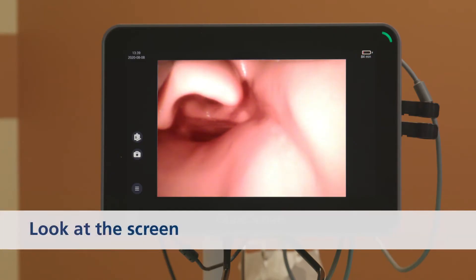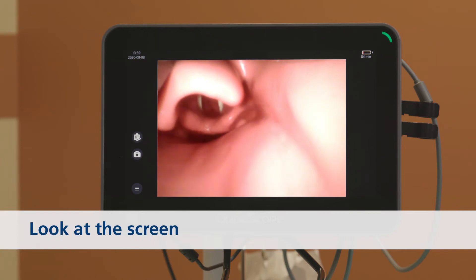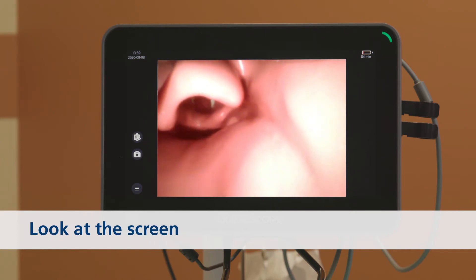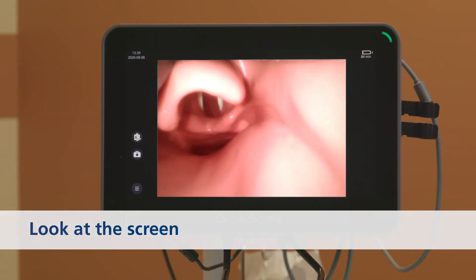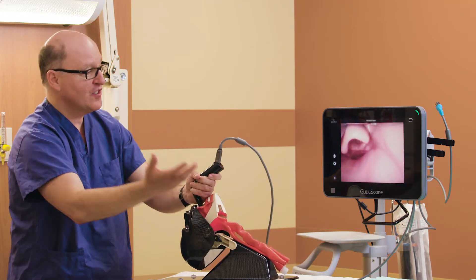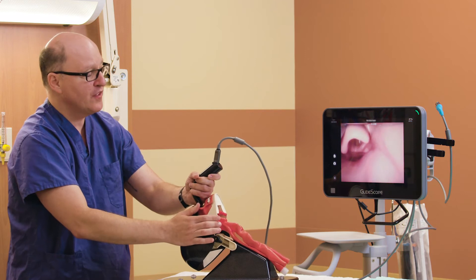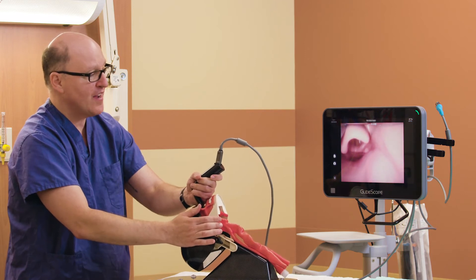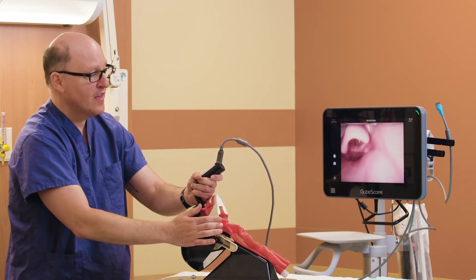If we go up to the video screen, however, now I have both eyes on the monitor and there's an entire room full of people who have eyes on the monitor.